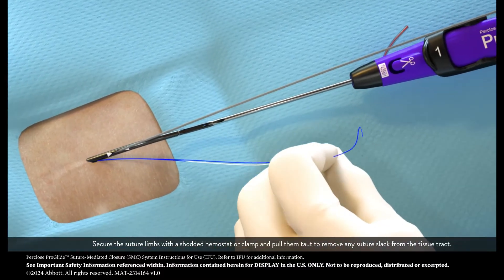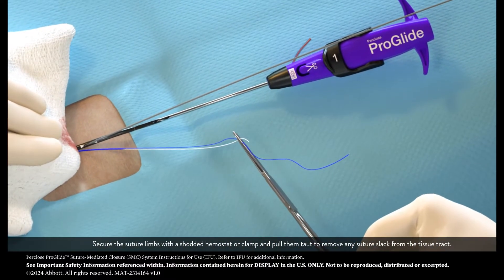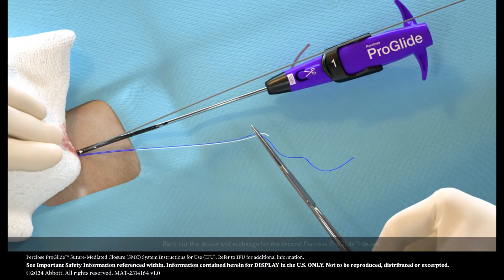Secure the suture limbs with a shotted hemostat or clamp and pull them taut to remove any suture slack from the tissue tract. Back out the device in exchange for the second per-close ProGlide device.